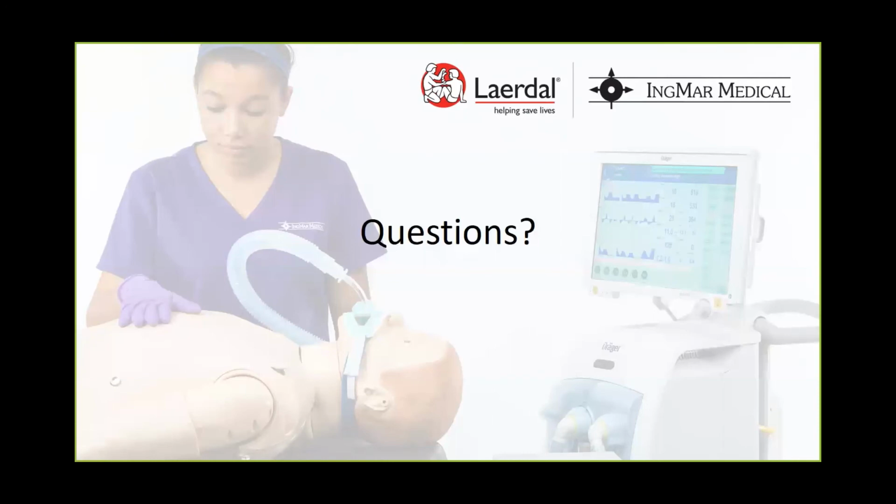Our next question is for Brian. Brian, we have someone who already has an ASL 5000. Do they need a hardware upgrade for their ASL 5000 to be compatible with the lung adapter? Okay, so if your ASL 5000 serial number is 1065 or higher, your unit is already compatible with the lung adapter and does not require a hardware upgrade. But if your serial number is below 1064 and has not been previously serviced, then please contact IngMar Medical and we will help you determine the steps necessary to make sure it's compatible.